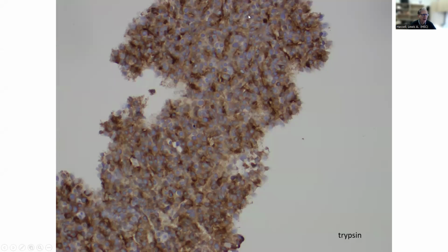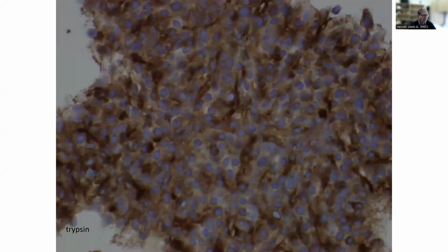Here at higher magnification, we can see it's not involving the nuclei at all. And we can see these areas of accentuation around areas where the cytoplasm is abutting the potential acinar lumen or that sort of central space. And then here again, higher magnification, you can see the nice granularity to this staining within the cytoplasm, sparing the nucleus and some of the other areas.